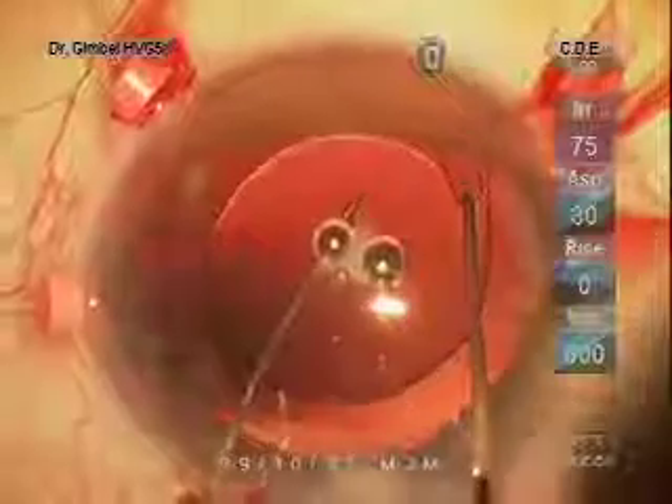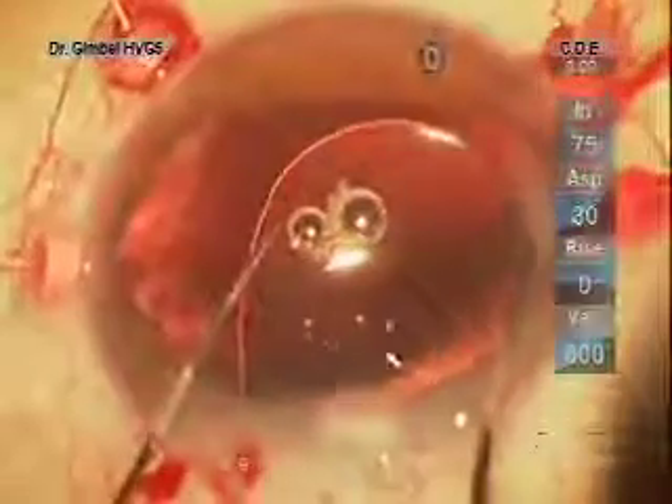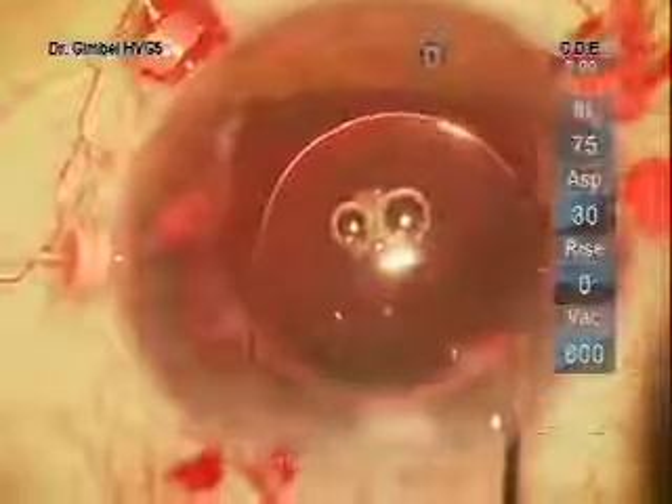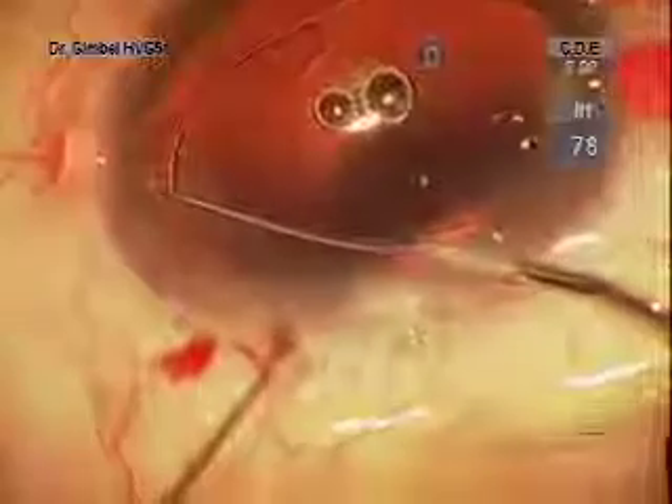This one-piece lens is attached to the membrane with one haptic that we have to loosen to rotate it to a position where we can use the suture technique. In the process of rotating this lens, one of the haptics came into the anterior chamber and we'll have to reposition it again behind the iris.